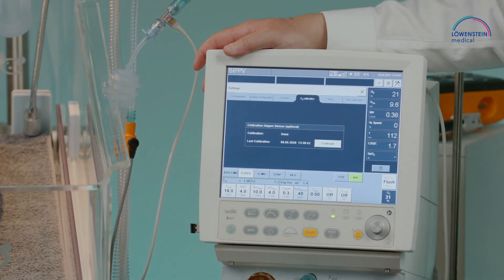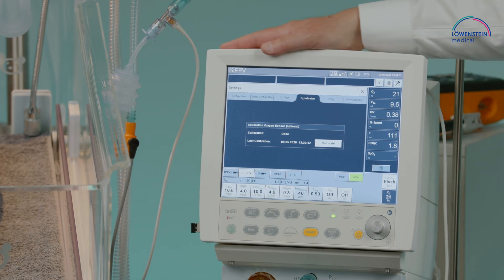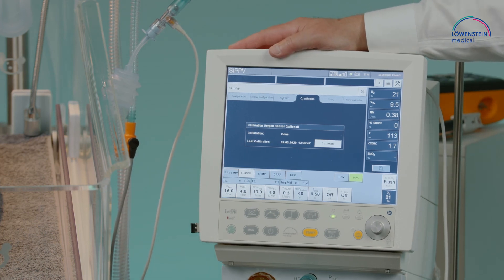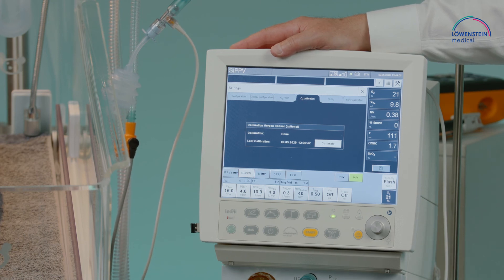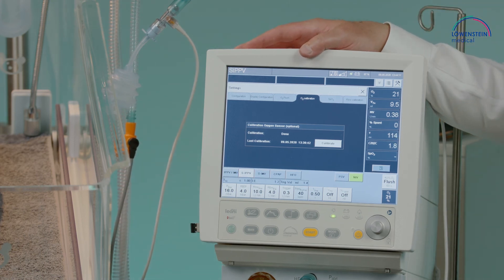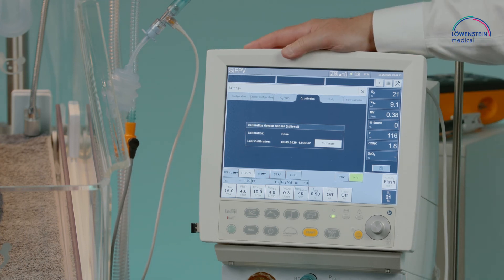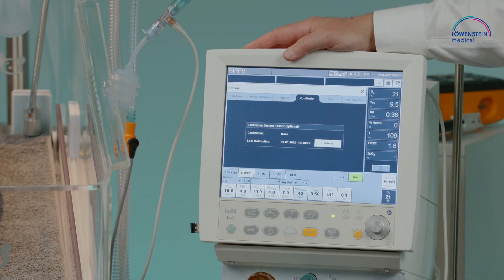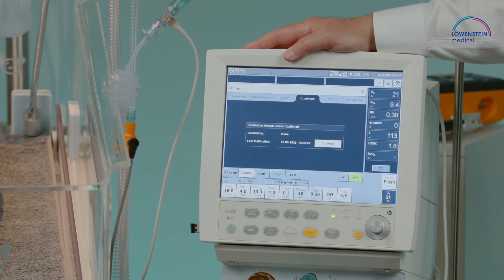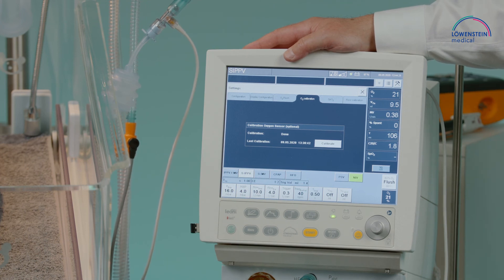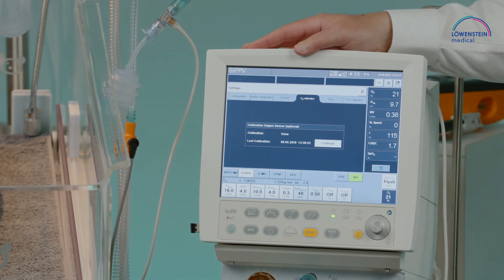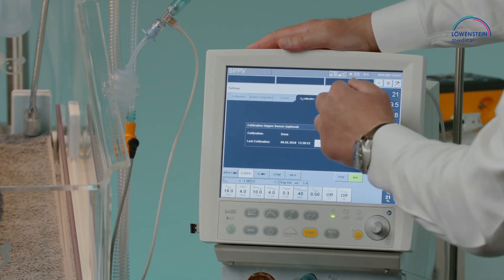There is an opportunity to initiate and start an oxygen calibration, though this is normally not needed as the system performs an automated calibration of the oxygen cell every 24 hours automatically — without any influence on the ventilation. This is called a bypass calibration.